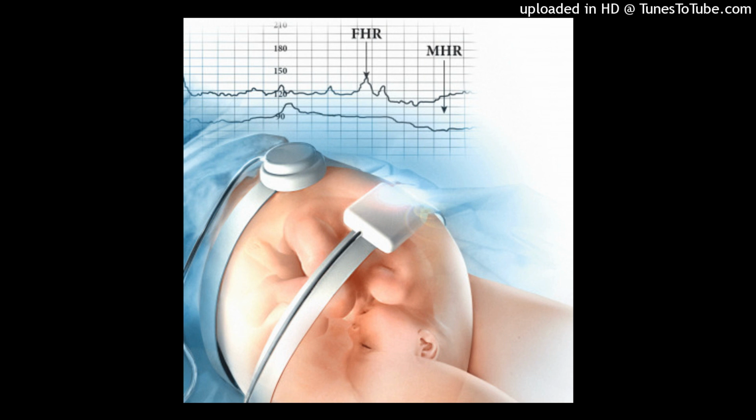Bedside fetal monitor and transducers. Instrumentation used for EFM include a bedside fetal monitoring unit and transducers with cables to capture data, figure 14.3. Fetal monitoring units collect FHR and UA information to provide a visual output in the form of a numerical display and a graphic strip, figure 14.4. Some monitors can simultaneously record twin and triplet heart rates. Current systems have inputs to collect maternal data, including temperature, oxygen saturation, electrocardiographic status, and blood pressure.